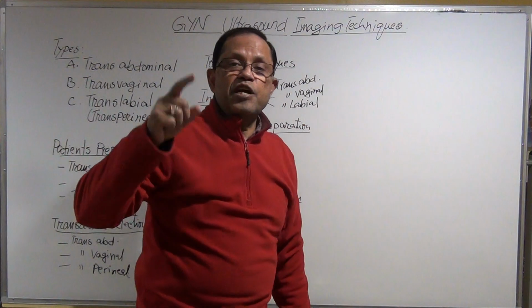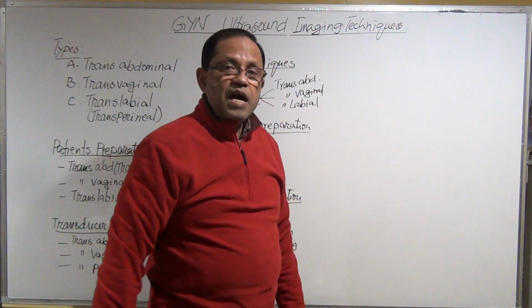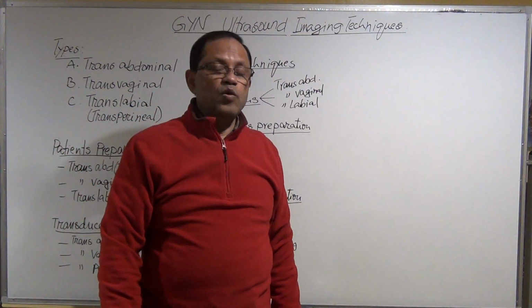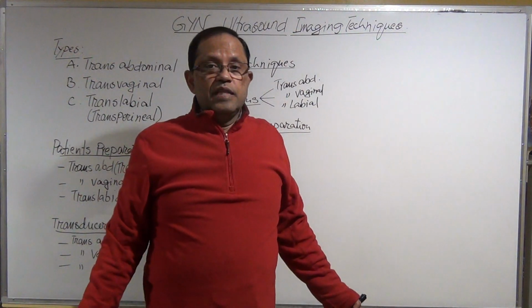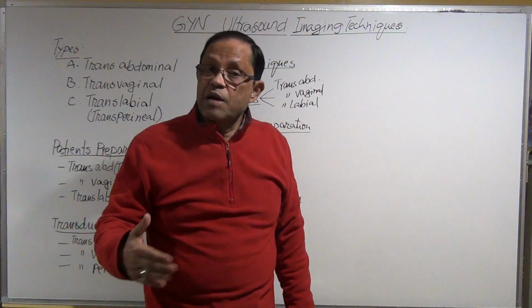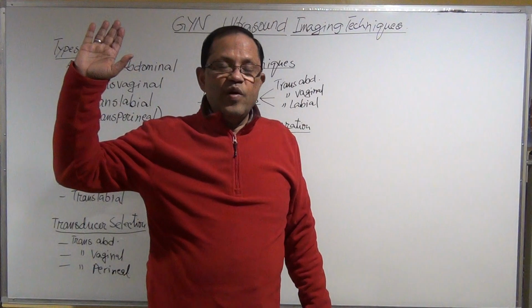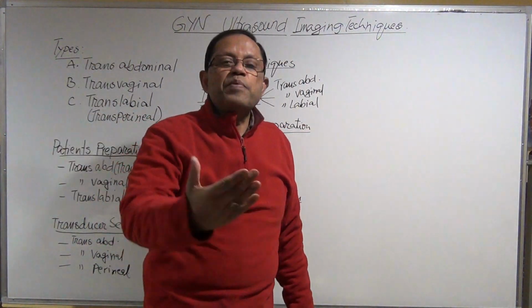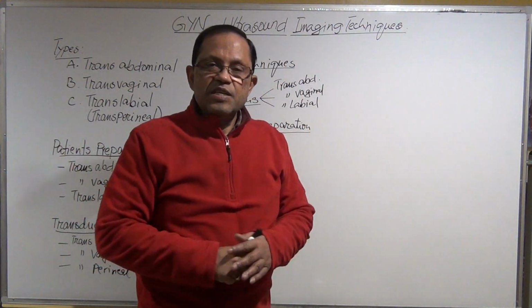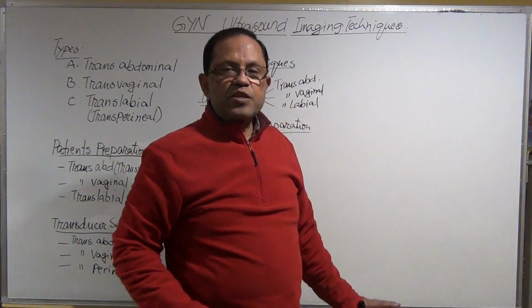Sometimes you will see that transvaginal ultrasonography is contraindicated. The patient has to be scanned through the bladder, no matter what. So I need the full bladder. Sometimes you will see the bladder is not full, but no problem. Let me take a couple of images and I will see it is inadequate, it is limited. So I will ask you to go to the bathroom, empty as much as possible, and come back.